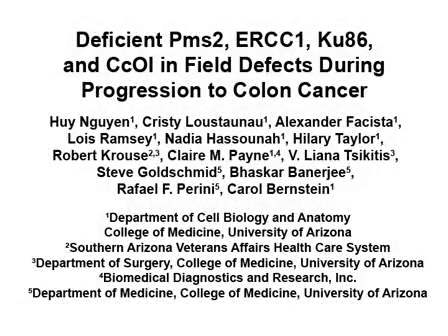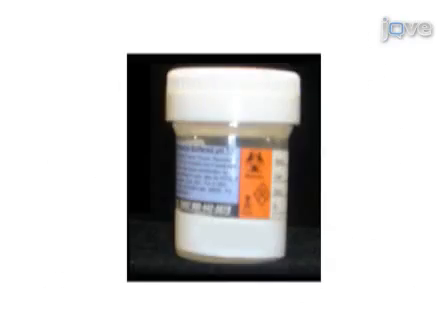The overall goal of this procedure is to determine the particular alterations in DNA repair protein expression, or expression of proteins related to apoptosis, that are frequent in areas surrounding colon cancers and thus likely to be central to progression to colon cancer. This is accomplished by first collecting tissue samples in formalin jars, either from normal colonic mucosa during colonoscopies as control tissues, or colonic mucosa adjacent to colon cancers from colon resections as experimental tissues.